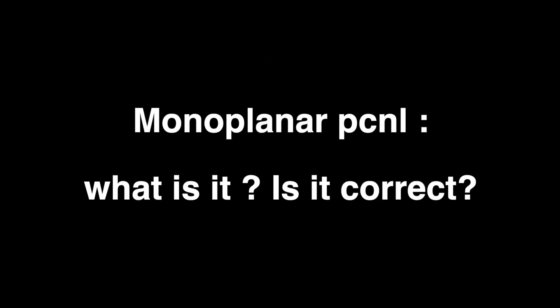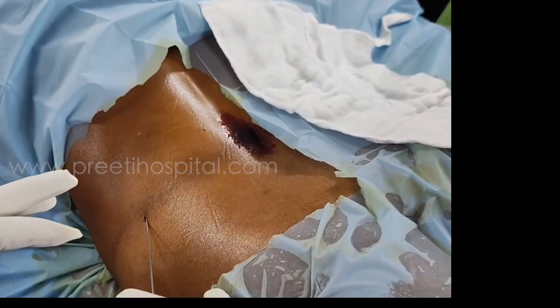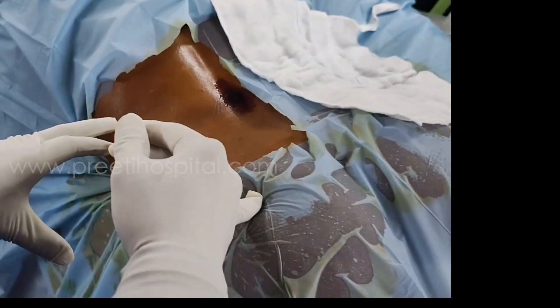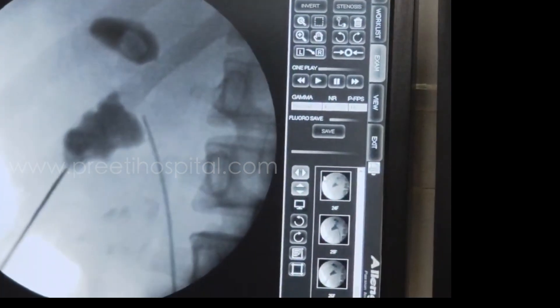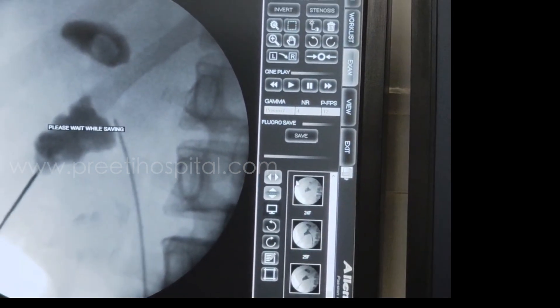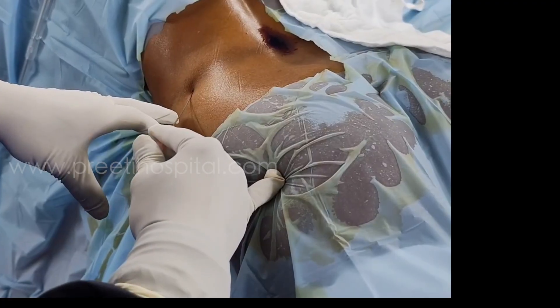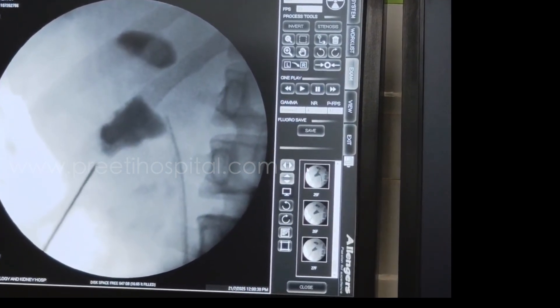Here is a case of monoplanar technique where you are putting the needle in one direction fast. Now you increase the depth. You are going in deep and the kidney is not moving. That means the needle is either superficial to the stone or deep to the stone. Now what the surgeon will do — he will decrease the angle. He will go again from the skin level and move in the direction of the stone. See, it is moving very well now.